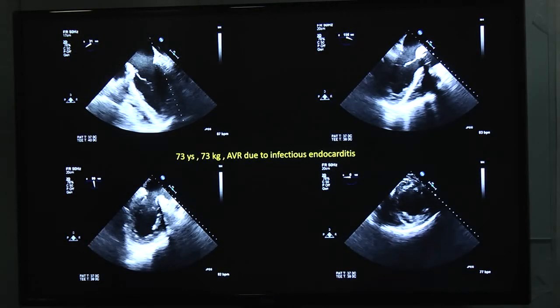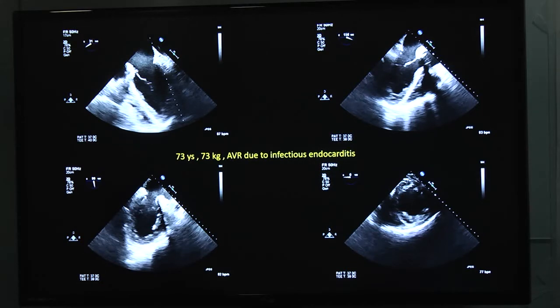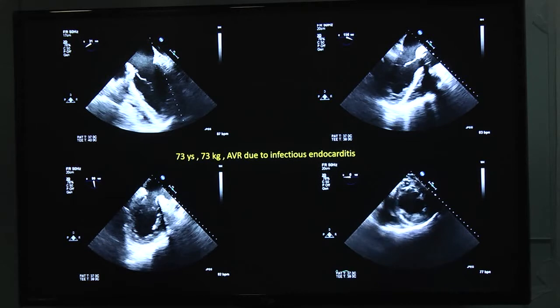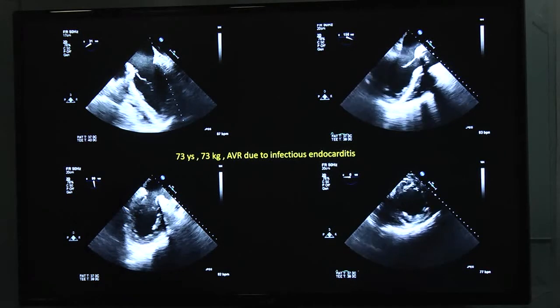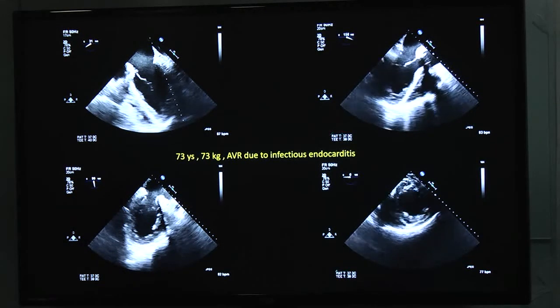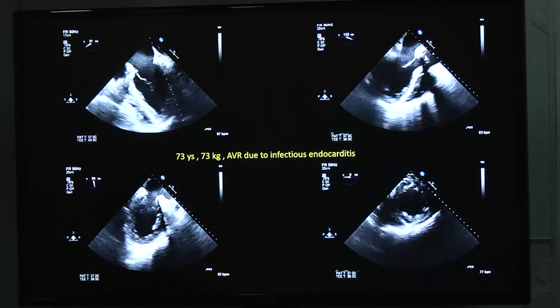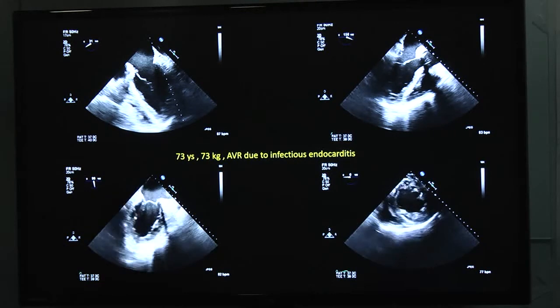The first thing to do is eyeball the heart. It's a very quick method — takes about 10 seconds — and gives us a subjective analysis of global function. We observe if the walls are getting thicker or not, and in the short axis if they are coming to a central point. In mid-esophageal longitudinal views, we can see longitudinal movement if the base comes down and apex comes up. In a few minutes we can see that this heart is not beating so well — probably a moderate dysfunction.